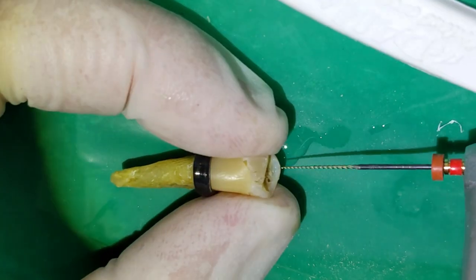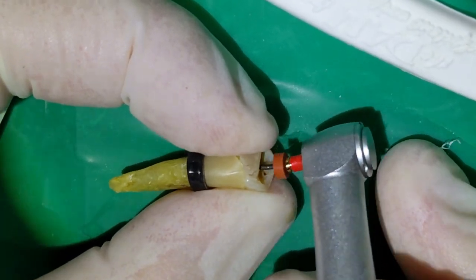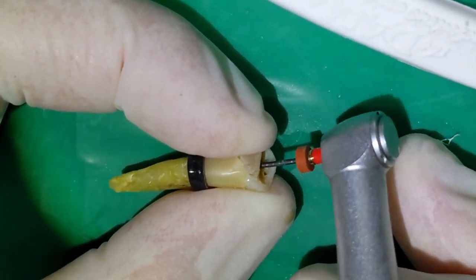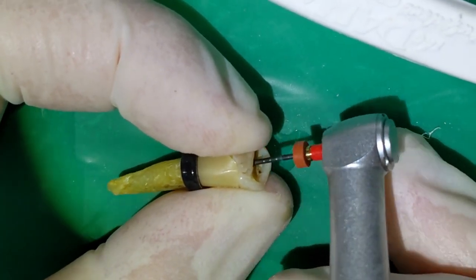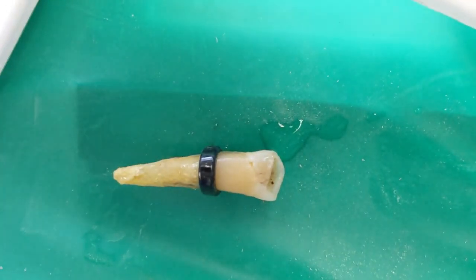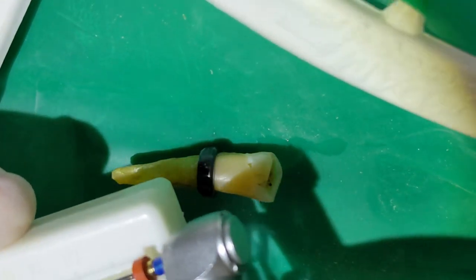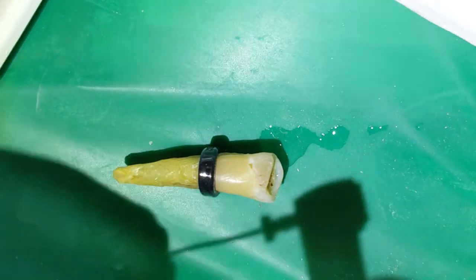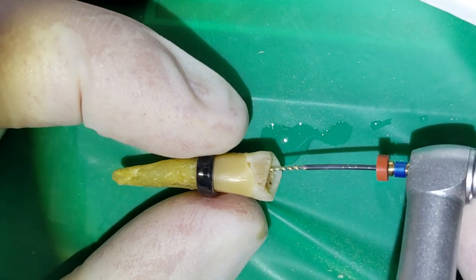Everybody's got a little bit different philosophy though, because I know one dentist who will use a number 20 for everything. He just files all the way around, makes sure he cleans everything up. And that's pretty much almost the only rotary file he'll use. We're getting a 25 to length. Great. And let's get up to the 30. And then when he goes to fill it, he'll match the gutta percha cone to the size of the tooth. I just like going up to a 30. I try to do a minimum of a 30 on most teeth. Some I'll do bigger.